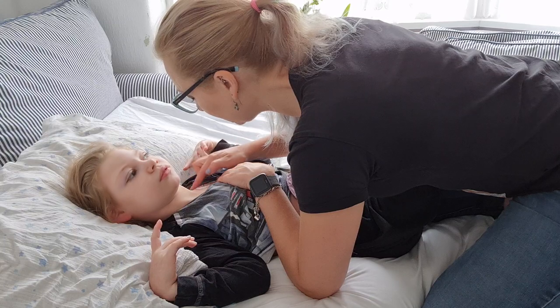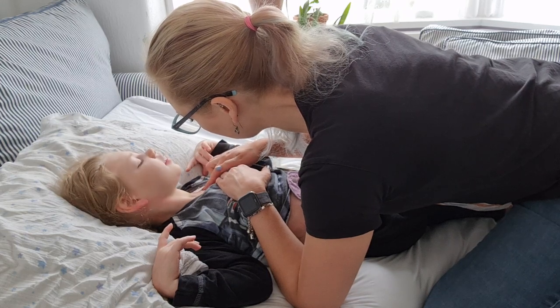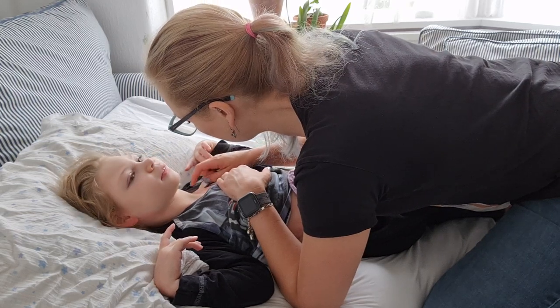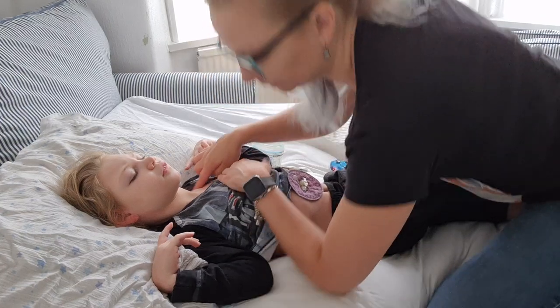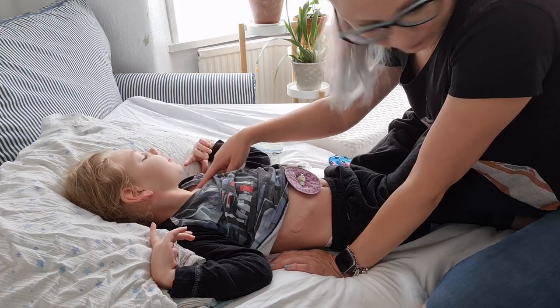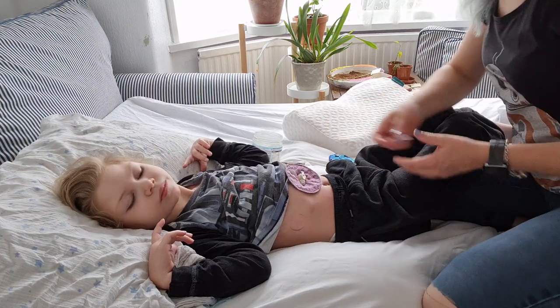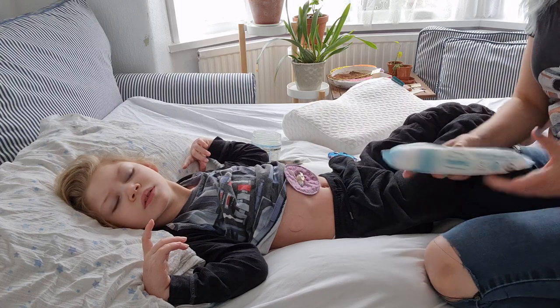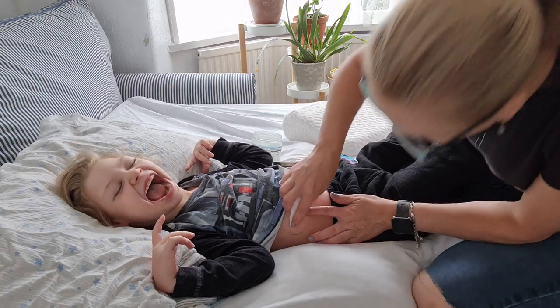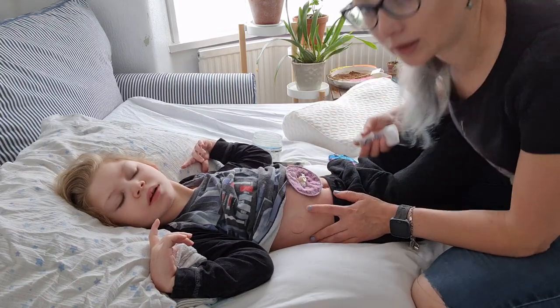Okay, and then the last one. Hi, you're ever so patient. And I'm getting in underneath. Oh, there we are. And now that's off. I'm going to rub the oil in. So all the stickies are off. I'm just going to get a clean wet wipe and get the sticky residue off with that.